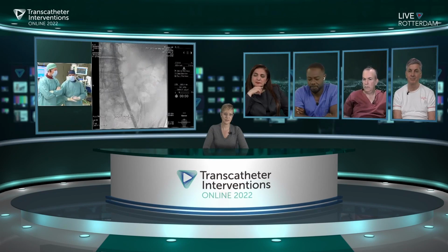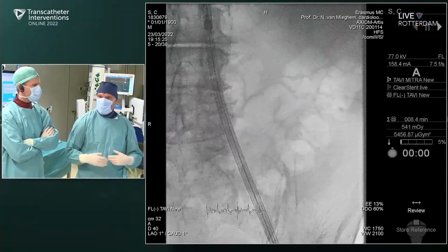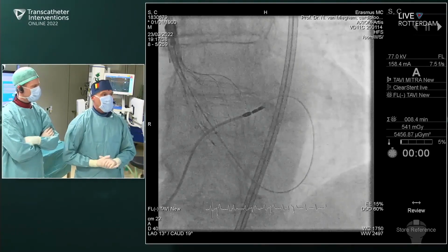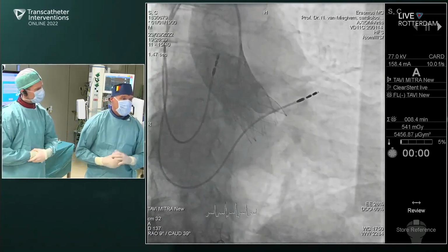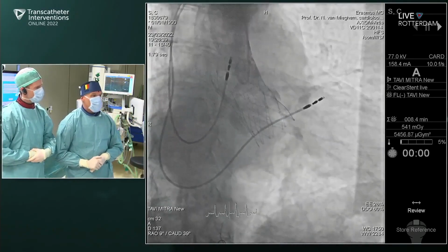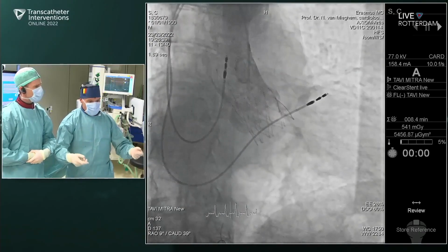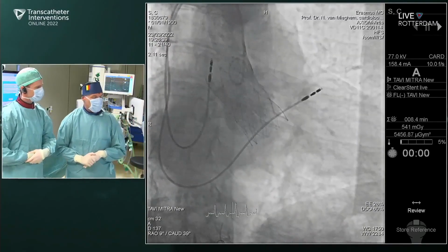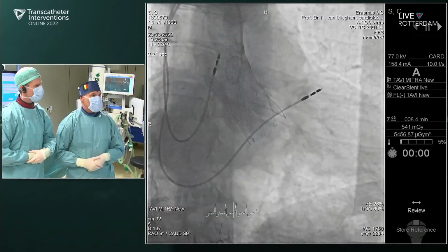That's a very on-topic question, and I totally agree with you. The stakes are much higher now. We have to be considerate for coronary accessibility. So we also try to achieve commissural alignment, and so with the NEO commissure. Lars did a lot of research on that, and we typically use his recommendations. So we inserted the system with the flush port upwards at 12 o'clock. And that gives you already a high likelihood of commissural alignment.